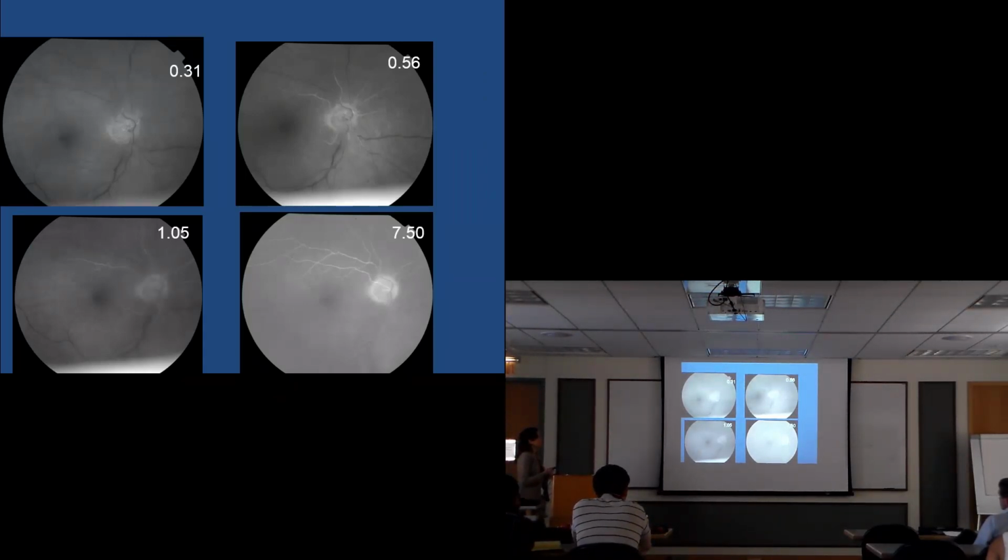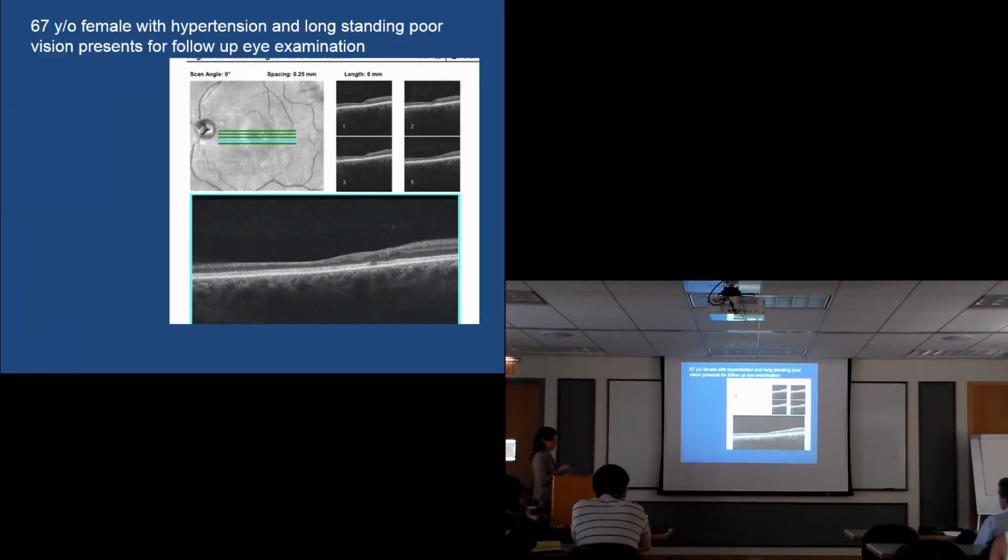We're also able to use a fluorescein test and show that this dye should enter within 10 seconds. She's so delayed, and the arteries are barely filling and completely not filling down here. That's because of the diagnosis of arterial occlusion. In this patient, because of the atrophy of the nerves after that kind of intense insult and poor blood flow, you can see the entire inside neuroretina is gone, but the photoreceptors are completely healthy.